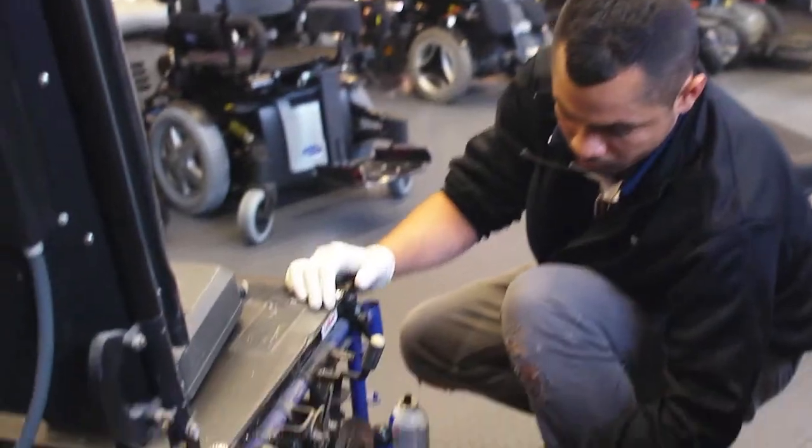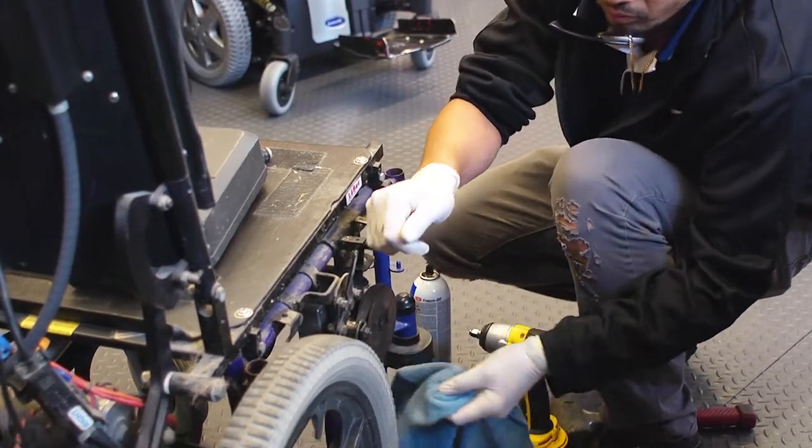When you're getting a new power chair, actually that's the first thing you want to consider: if the company you're getting it from has a repair shop. So if there is a problem with the power chair, they're going to be able to fix it. You want to be able to pick up the phone and call that place for them to come and take care of it. So when you work with a company that from the beginning you're having difficulty getting hold of, know what's going to happen if your equipment breaks.